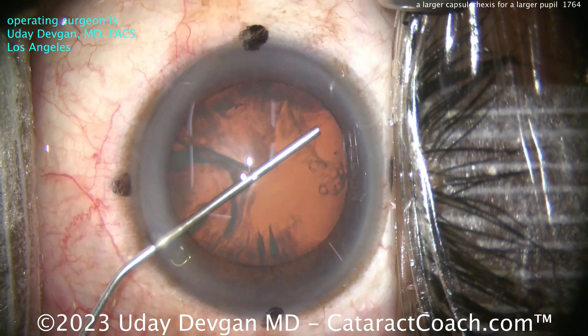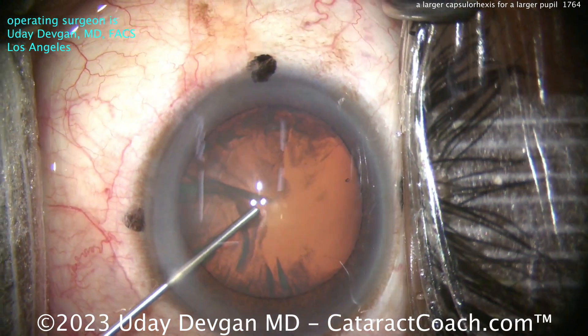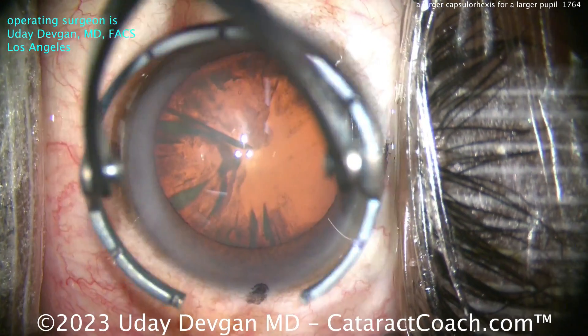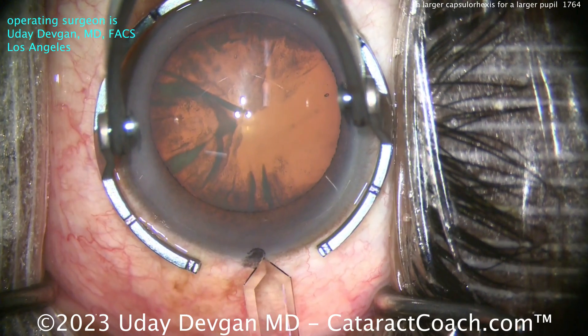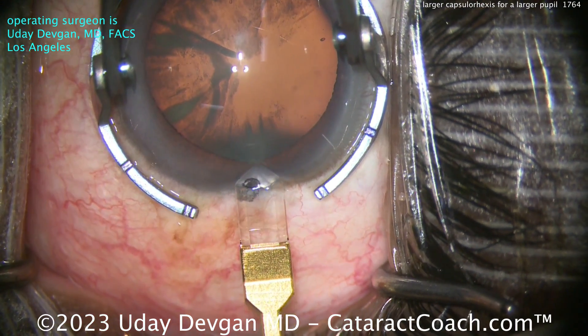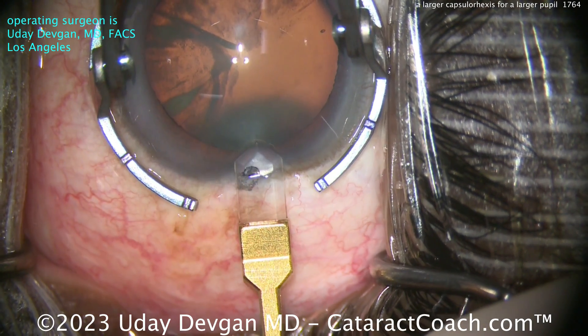So it's going to be otherwise a routine case, but the important part here is because the patient has large pupils in mesopic conditions — those twilight conditions — the patient has pupils that are about six millimeters. You want to have a rhexis that's not overly small.